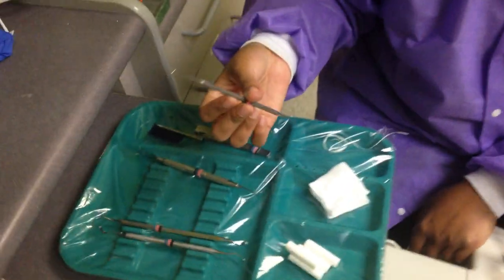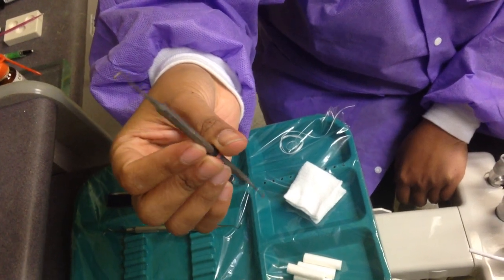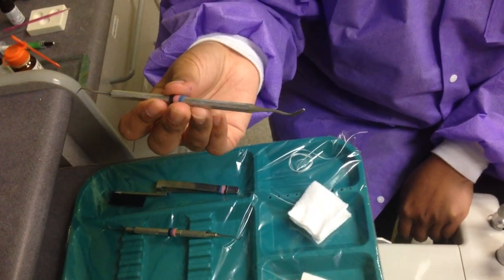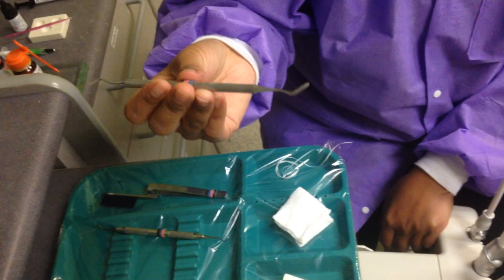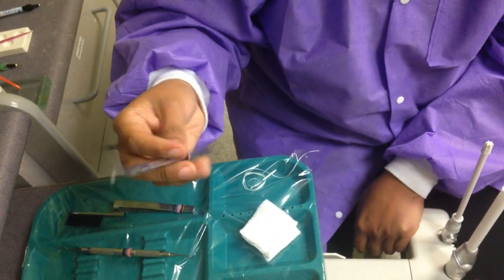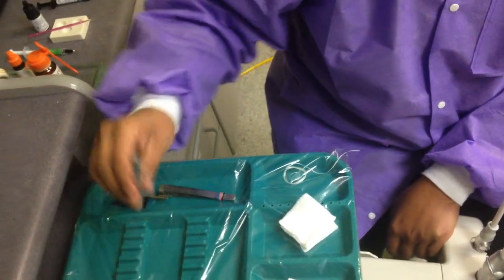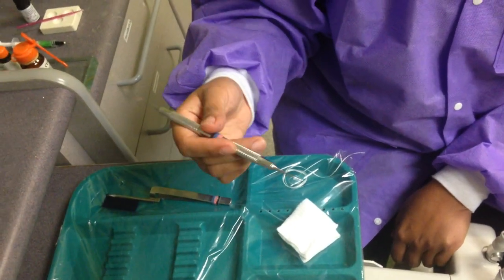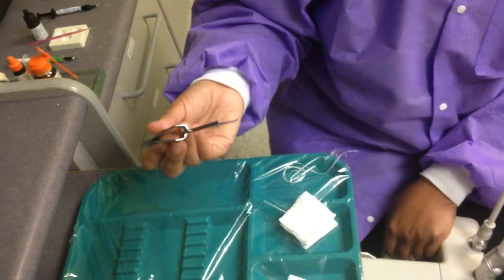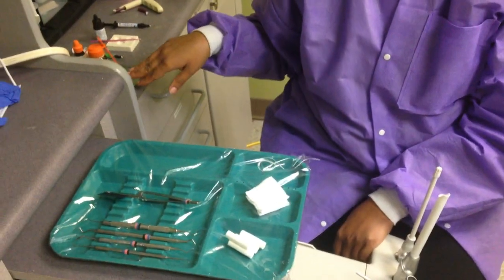Your instruments for composite: you have a spoon — the spoon is to take out caries, cavities. You have a composite instrument, or black instrument, for sculpting. You have a plugger or condenser for packing in the putty composite. You have a scaler for cleaning up the bond off the tooth, or to hold the articulating paper. And of course your spatula and your di-cal instrument.